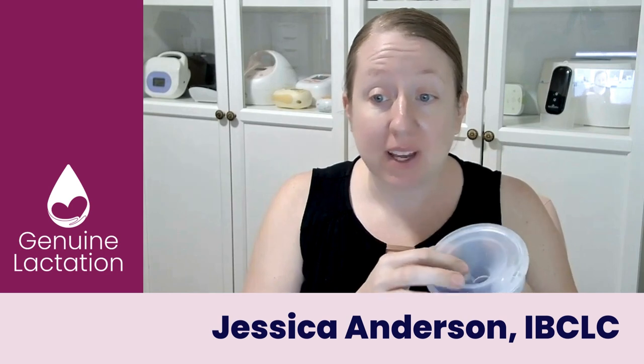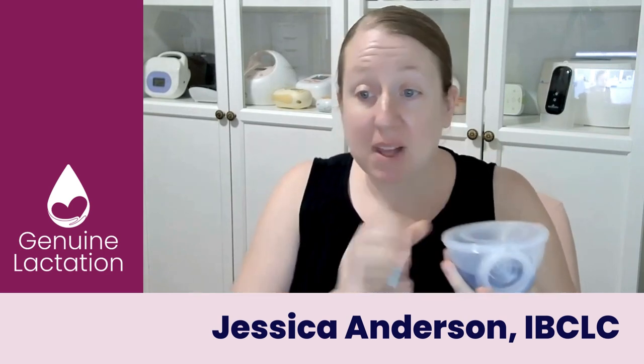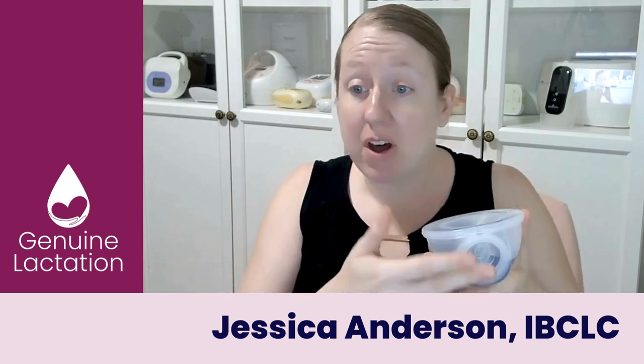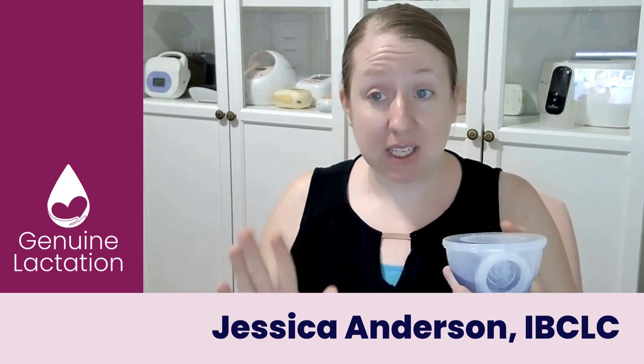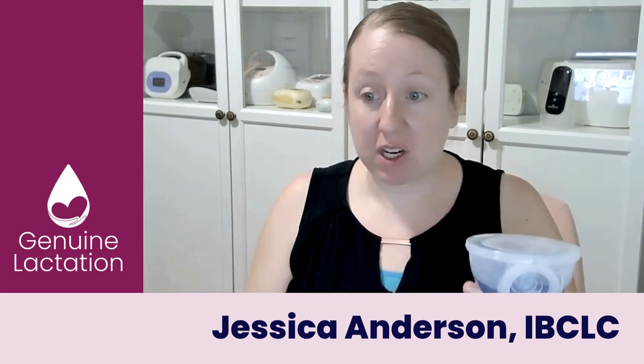If you see here, there's liquid here and there's nothing blocking the liquid. So we've got the cups. I'm holding them level as if I had pulled them out of my bra, taking the cap off. Obviously, this is not milk — I use blue liquid. It's a little bit easier to see so that you can see what I'm trying to do.